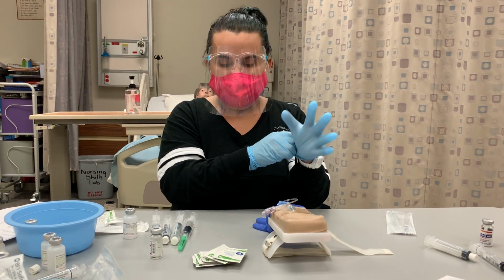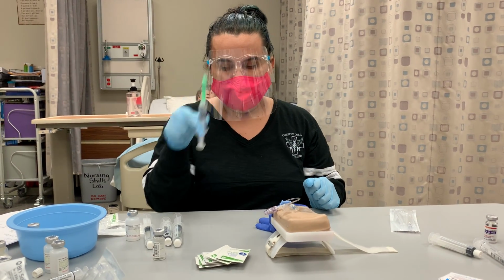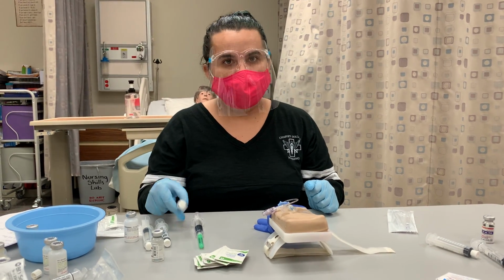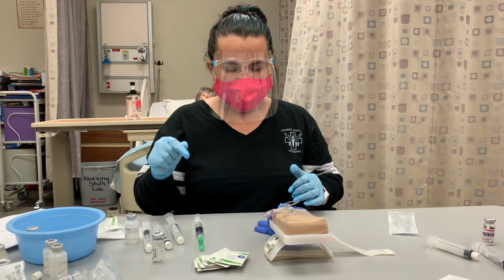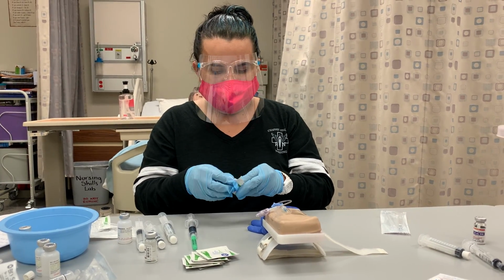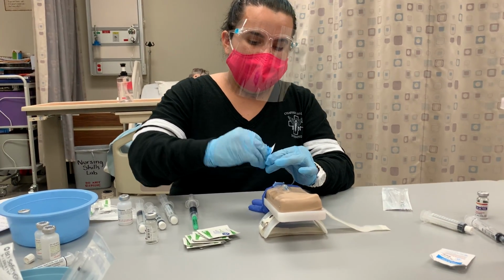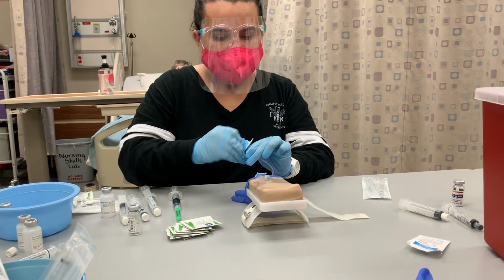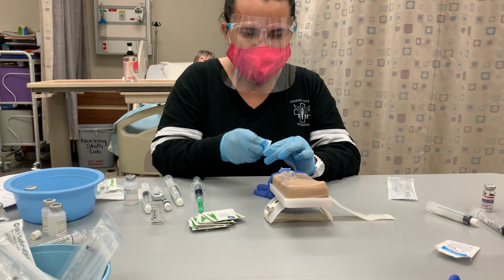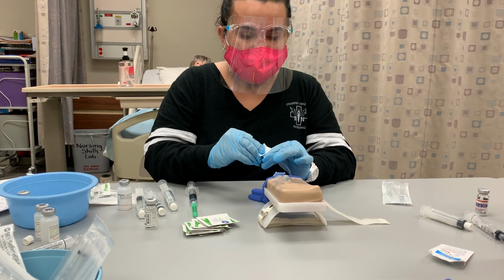And I forgot to mention, alongside my 6 mLs of medication, I would also have the same amount of normal saline, because I'm going to flush with that after the administration. So what I'm going to start by doing is assess the site. And by doing so, I'm going to be scrubbing the hub for 15 seconds. While I'm scrubbing, I am looking for any pruritus, any redness, inflammation, any drainage, anything that looks abnormal that might be a signal for me to put in a new IV.